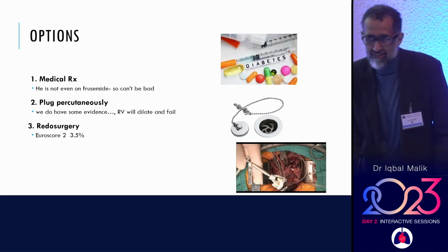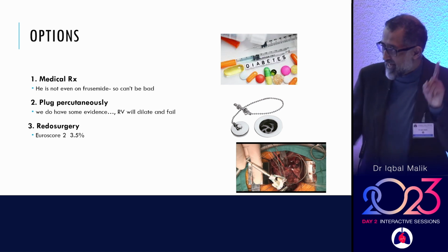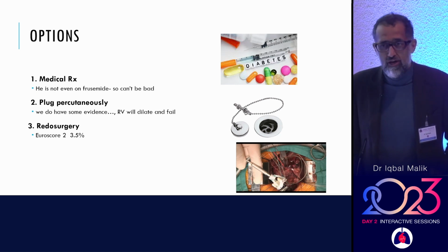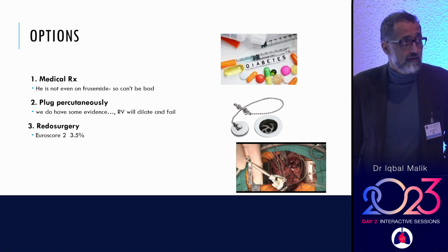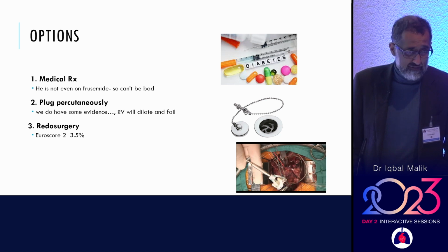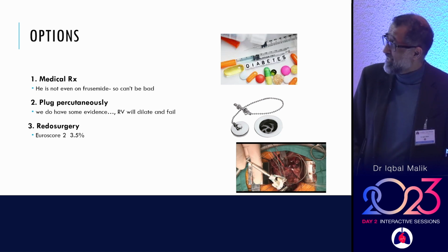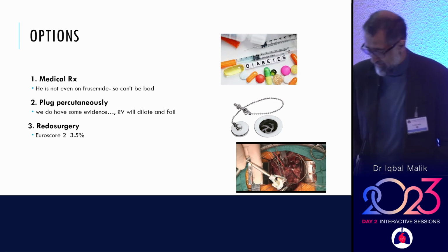Yeah, so the real question is, who in the audience actually has access to that sort of technology? We're already saying percutaneous closure. This is quite an esoteric hole. It's not even a standard paravalvular leak, it's an esoteric hole. So hands up who has in their unit someone who does this sort of plugging. Okay, so less than half the audience actually has it. And that's probably about average because there's a lot more percutaneous work around than there was. And it should be in the hands of one, maybe two cardiologists in each unit because you need to get your experience level up. This is not, I did one 5 years ago, I'm going to do another one. That's insane, okay? But there is a lot of insanity about.